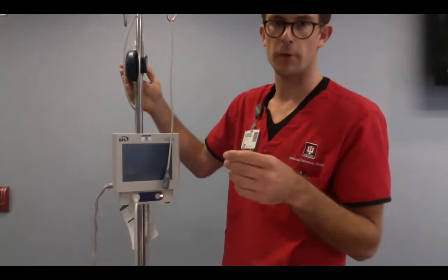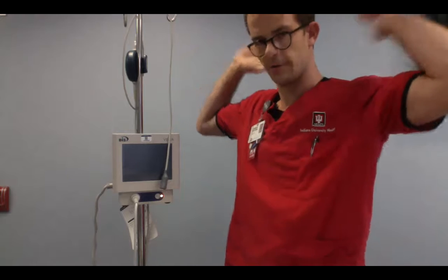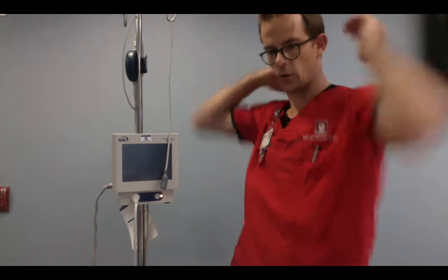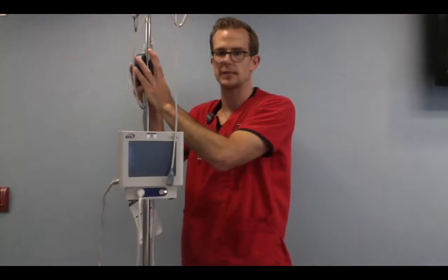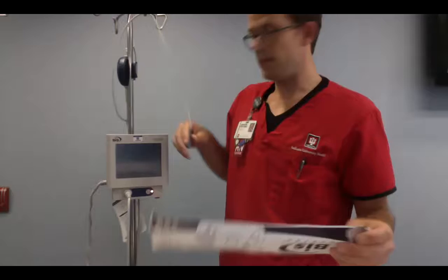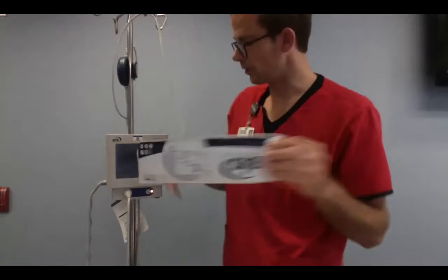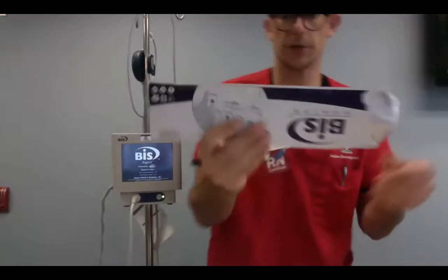If you're on a rotoprone bed, there are metal bars that secure all of the IV tubing that goes through the headpiece. And so you'd clip this because it's a little heavy and might pull at the BIS sensor. And then the BIS sensor plugs into this here, which I'll show you. So let's go ahead and fire this on. I'll show you this BIS sensor.